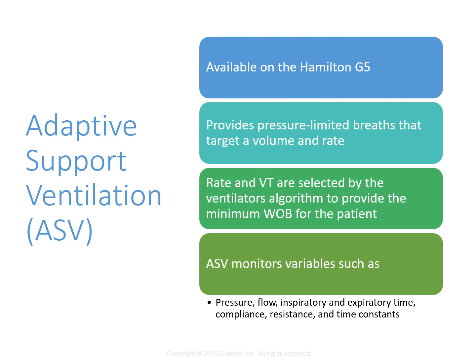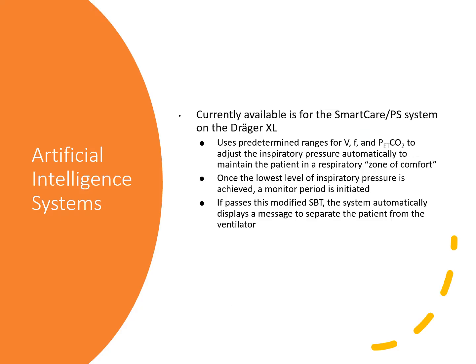It's also been studied as a strategy for weaning. ASV has also been shown to be safe and effective for traditional methods of weaning. And it has been suggested that it may find increased use in the future. So this artificially intelligent mode, adaptive support, might be something you'll see more of down the road.